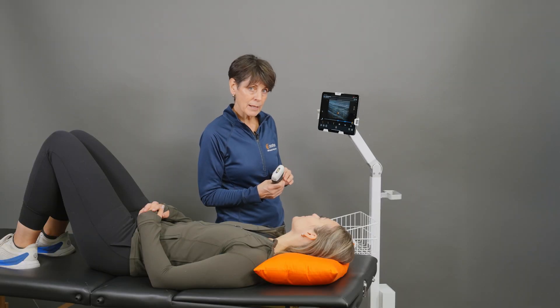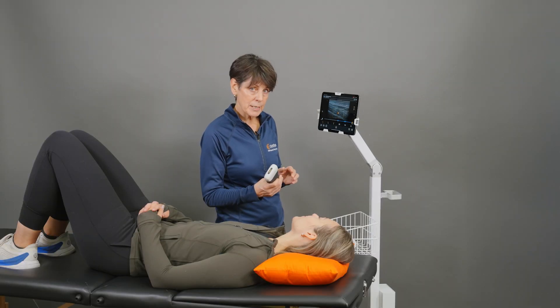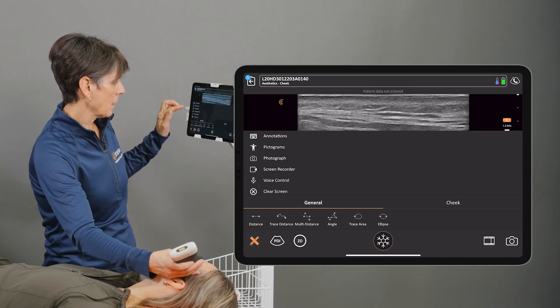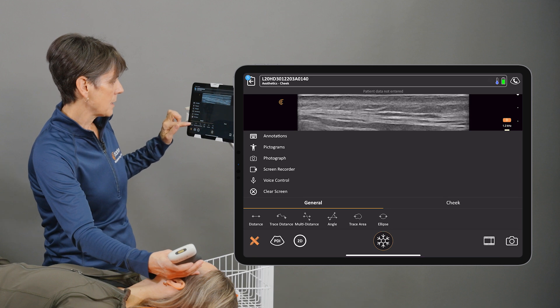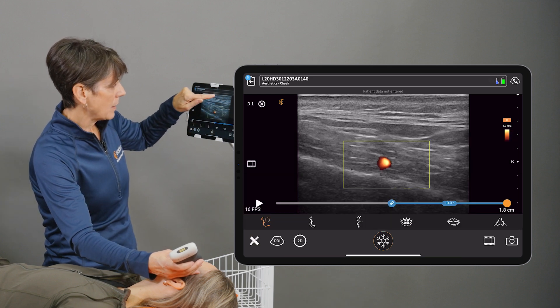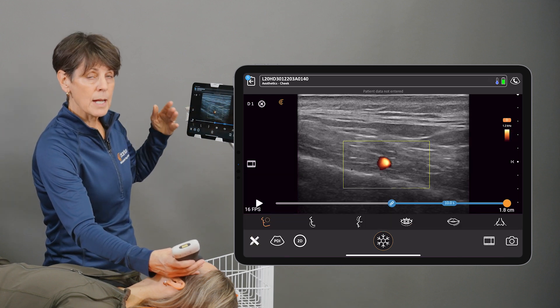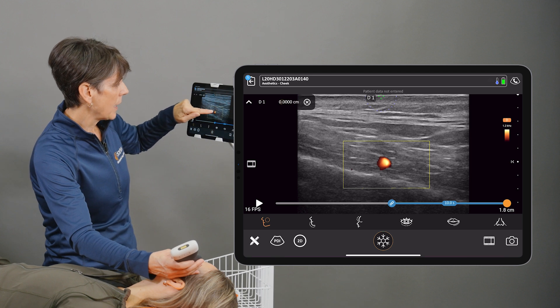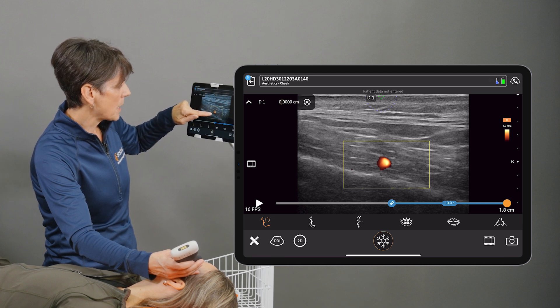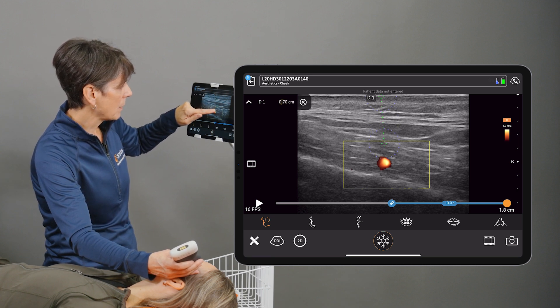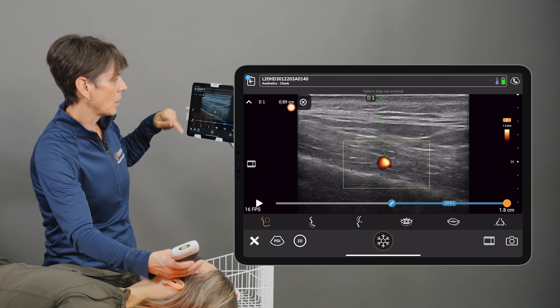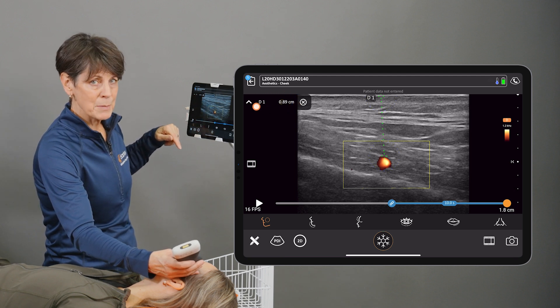The way you can do that on the Clarius app is to go into the tools menu and select distance. We've already established that the top of the image is the skin, and then we'll just measure the depth down to that vessel — and we're getting almost nine millimeters.